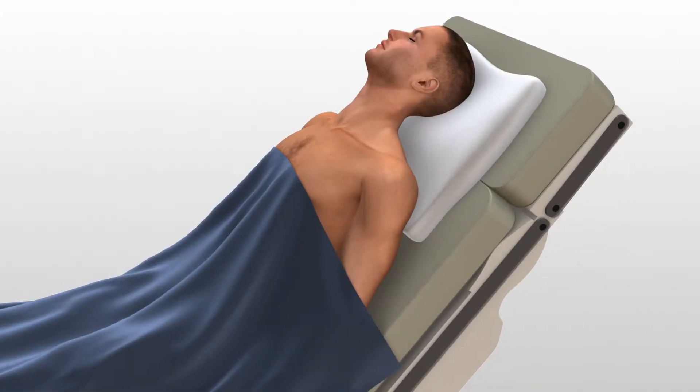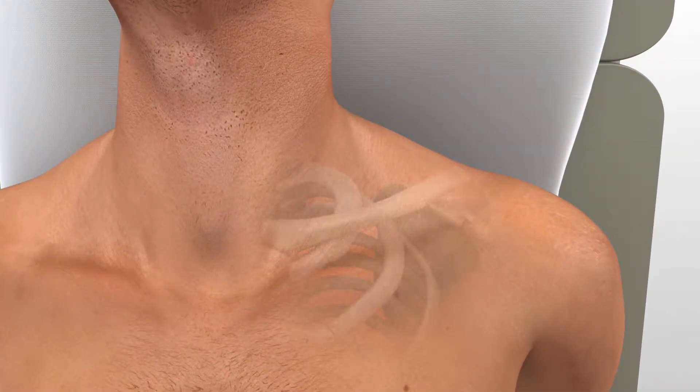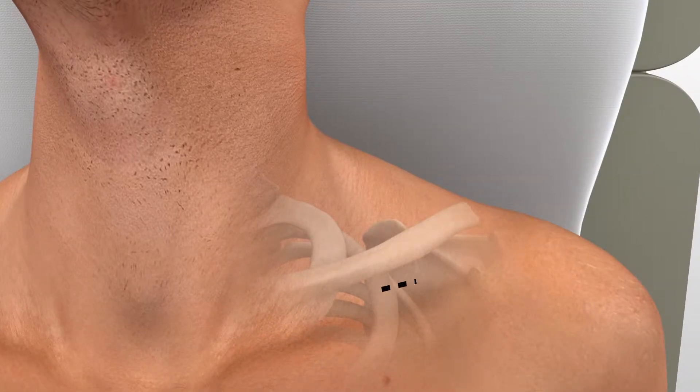Surgeons may choose between two incisions. Option 1 is a 3 cm to 5 cm transverse incision made inferior to the distal clavicle and AC joint. Option 2 is an incision along Langer's lines, running perpendicular to the long axis.